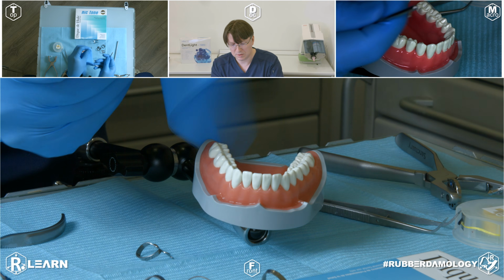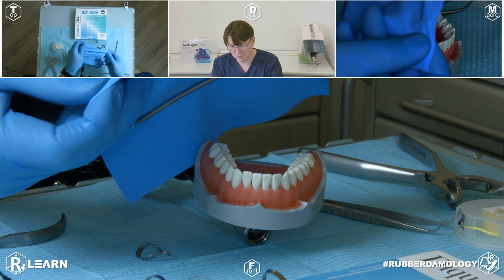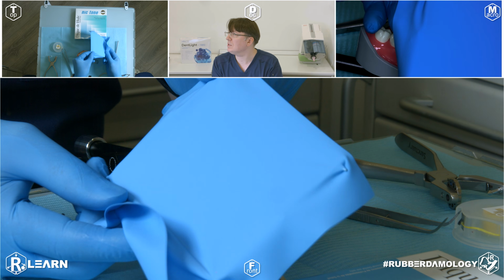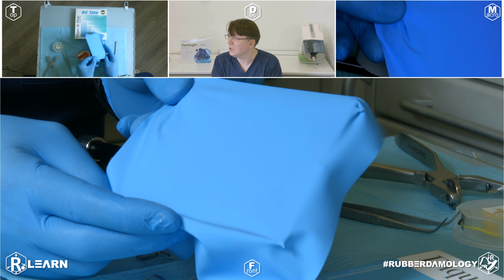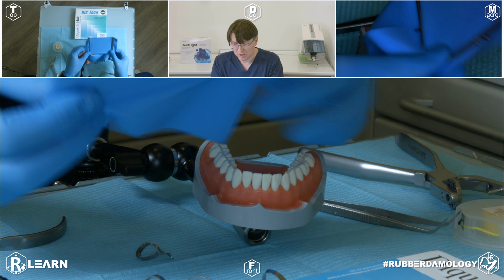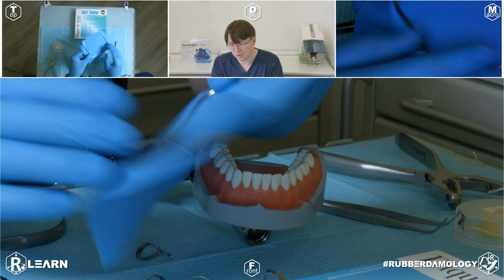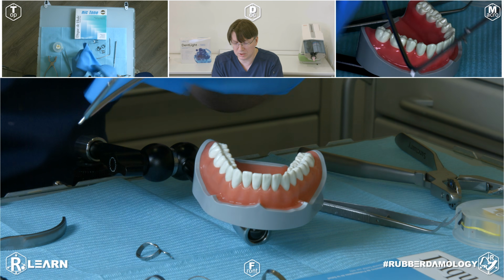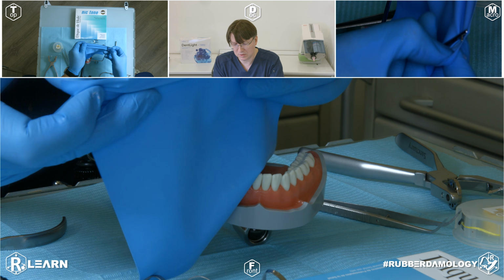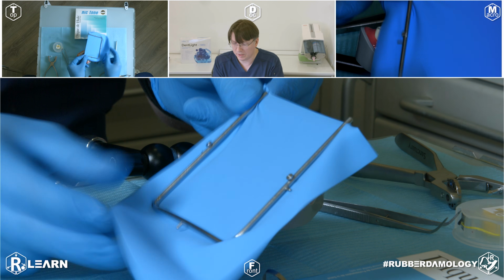Another way. I think this is a position for idiots, because you cannot make an envelope and the metal touches the skin or face of your patient. Why we do not need this. So every time place your rubber dam plate only one way, the correct way.